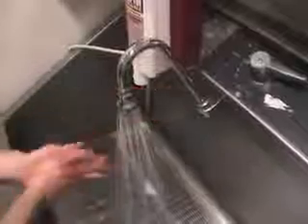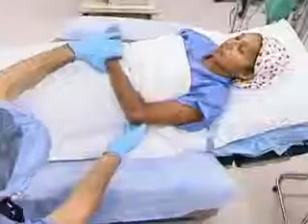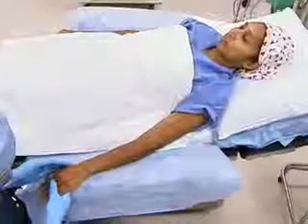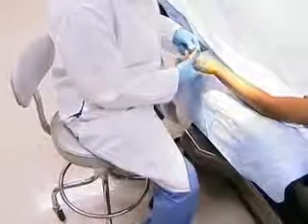You must follow standard precautions when placing a peripheral venous catheter. This includes washing hands, wearing gloves, and using eye protection because of the risk of blood splatter. When the selected site is in an upper extremity, the patient should be placed in the supine position with the arms supported. A comfortable position for the practitioner and proper lighting are important for successful intravenous cannulation.